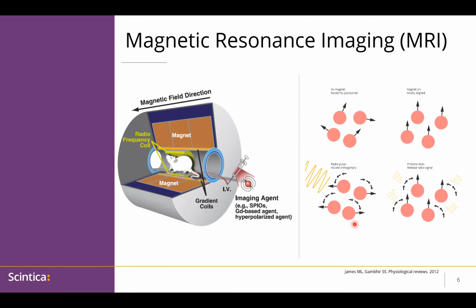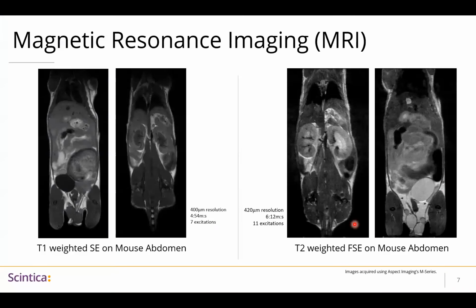And then the RF coils are going to receive the signals that we get back as those protons realign within the magnetic field. How they realign and the process that they take depends very specifically on the environment that those protons are located within. So now as we start to look at images, many people talk about different sequences that we take with MR, and many people will talk about a T1 weighted or a T2 weighted image. So let's talk a little bit about what that is.